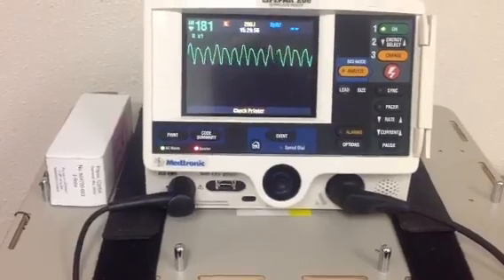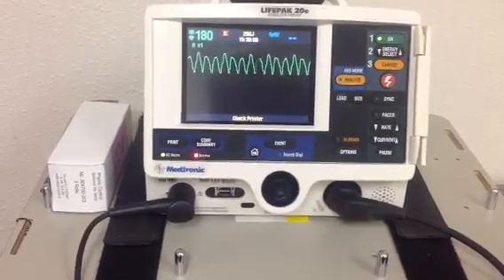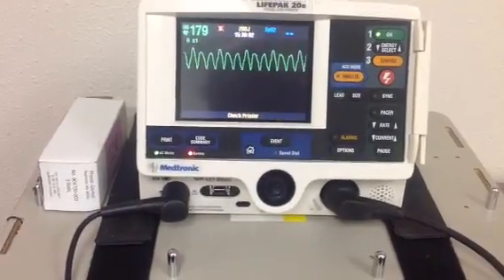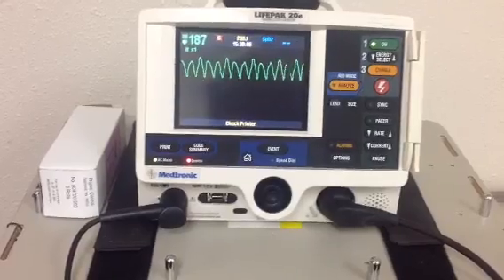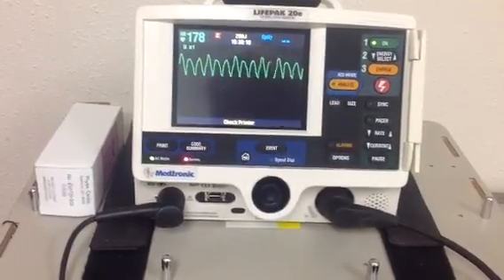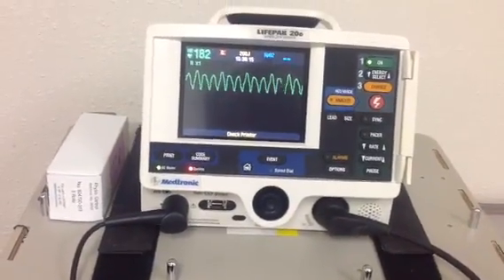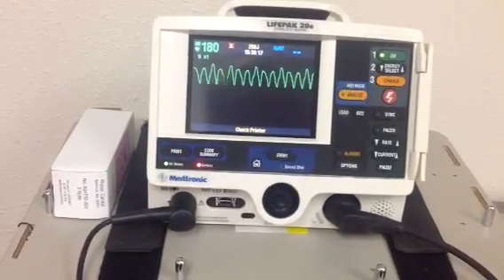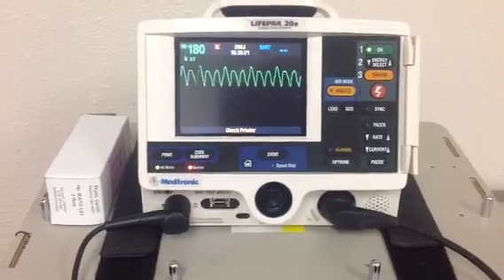That's a pretty ugly rhythm. This patient is in VTAC. First thing we always want to find out is does our patient have a pulse or not? This patient does have a pulse. What are his vital signs? Well, he's got a blood pressure of 120 over 80 right at the moment and he's having a little bit of chest pain.